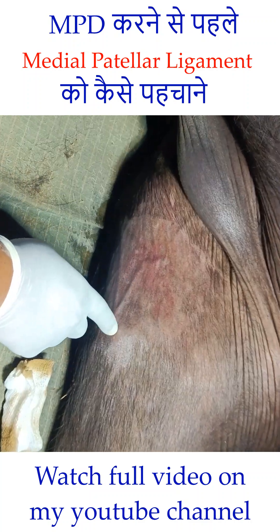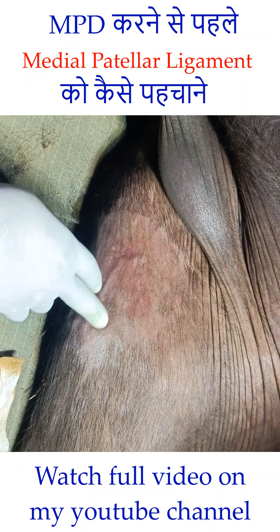For performing the medial patellar desmotomy, it is necessary that you should know the landmarks of the femoro-patellar joint.